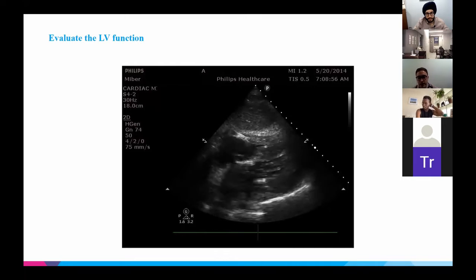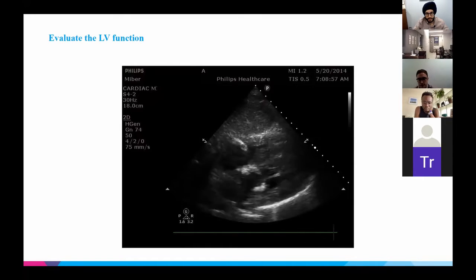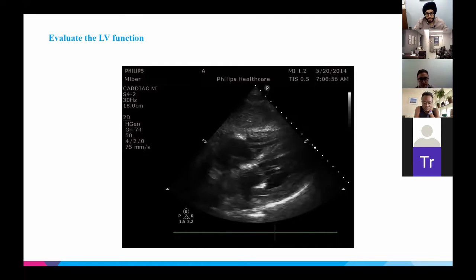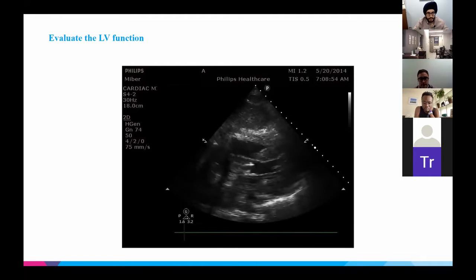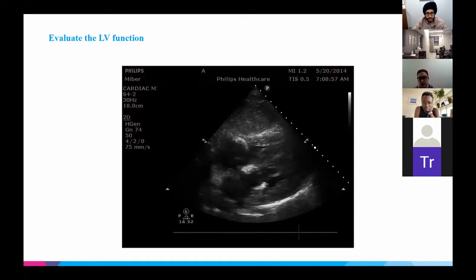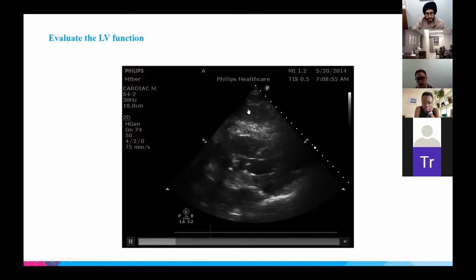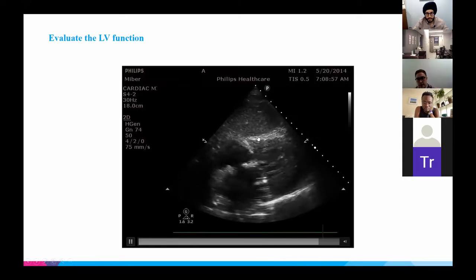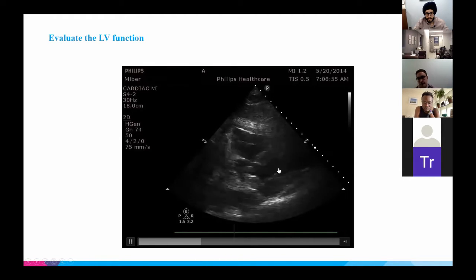And so what view are we looking at here? Yeah, subcostal. You can tell because this is the liver up top, which is our acoustic window for the ultrasound. The first thing the ultrasound rays meet is the right ventricle, and then the left ventricle is down here.